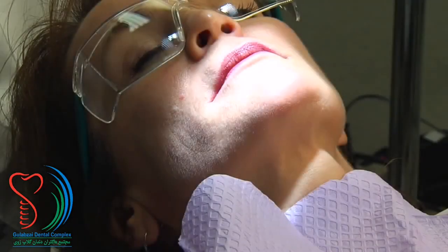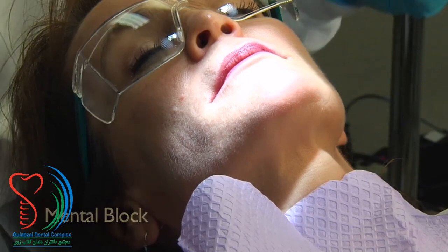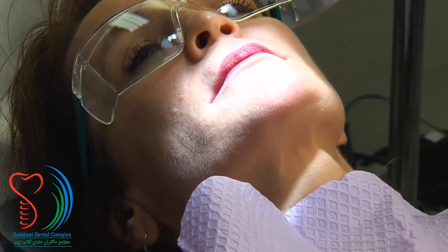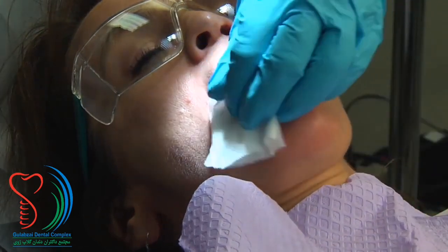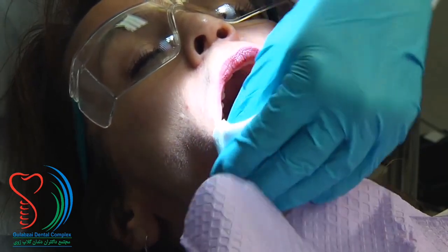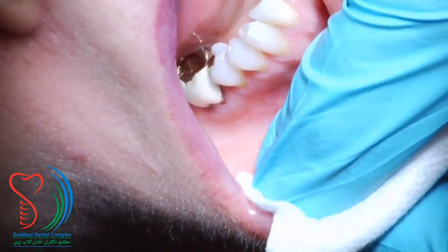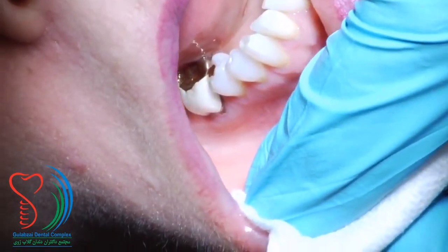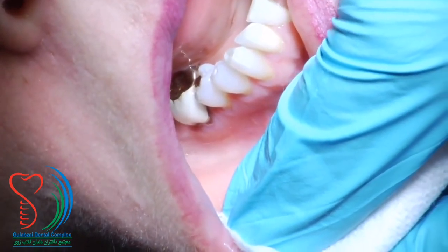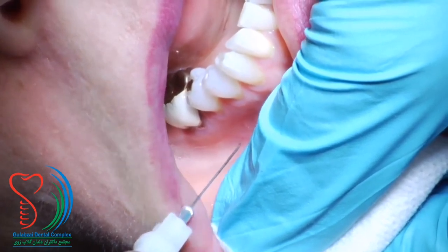For the mental injection, generally the operator is sitting above and behind the patient in about the 11 o'clock position, grasping the lip with the thumb and fingers and retracting so they can visualize the vestibular area and the premolar region. Pull out the lip with the thumb and first finger, pinching it slightly for distraction. The penetration site should be into the vestibular area in the region of the mental foramen, approximately at the apex of the second premolar.